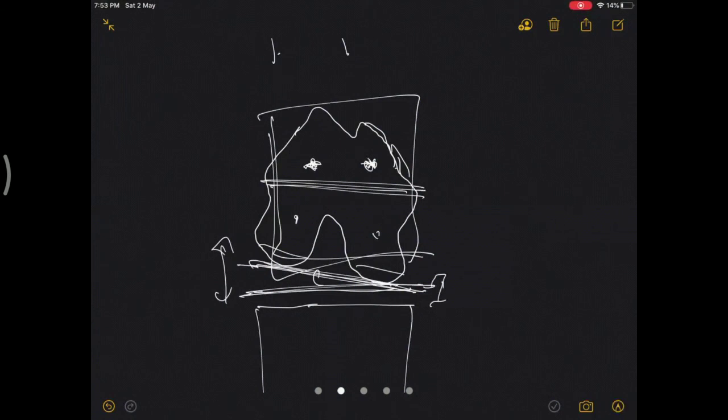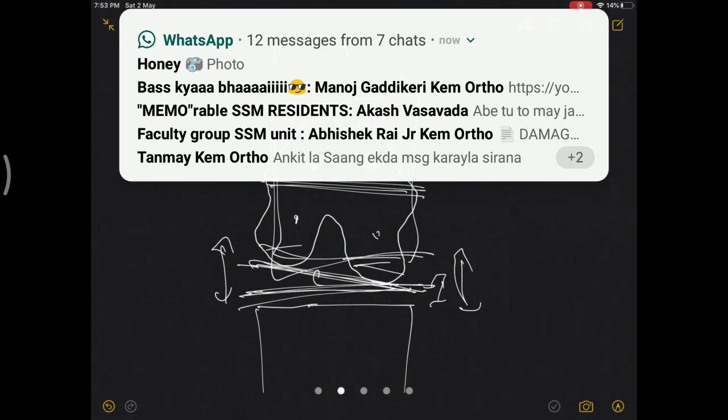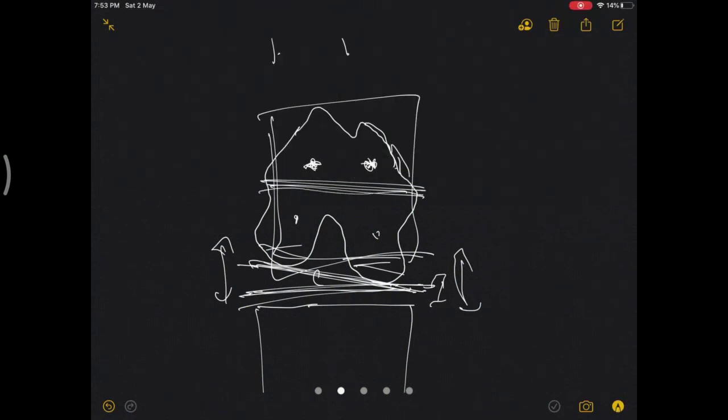Or if you are overenthusiastic with excess external rotation, then you will cut this medial condyle more than the lateral condyle, and there is an asymmetric flexion gap in both compartments. So this precise component rotation of the femur is very important, and you have some checks intraoperatively: the pins which you have put have to be parallel to this transepicondylar axis.